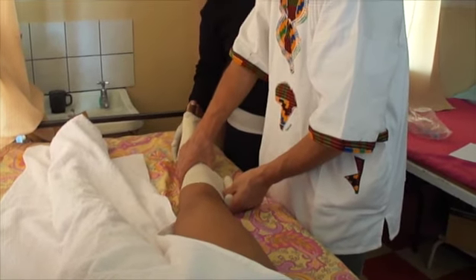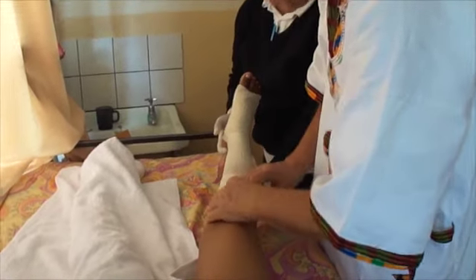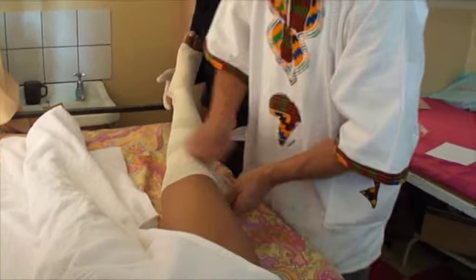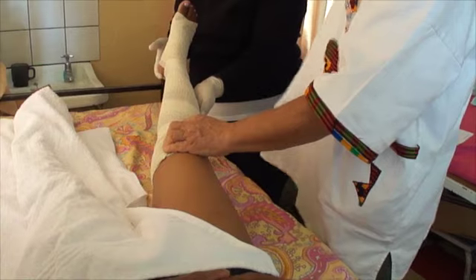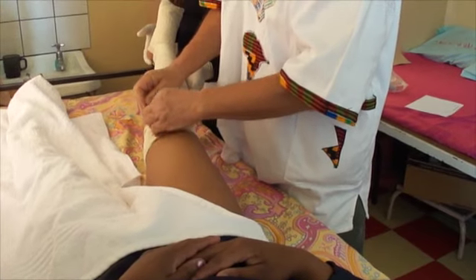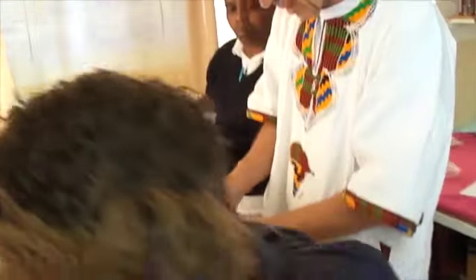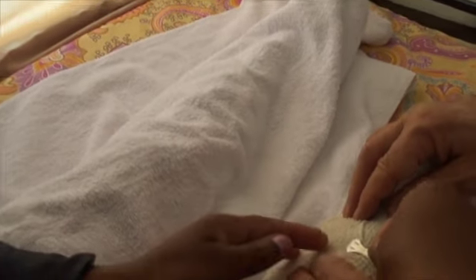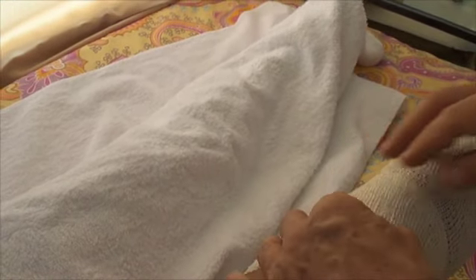We shall have a little bit more pressure down, and as higher you come up, the less pressure you apply. I am used to asking the patient to put it by himself, so the patient can feel if it is sticky or not. Put it by yourself. We don't want to harm. If it is a huge edema, just take a tape to fix it.